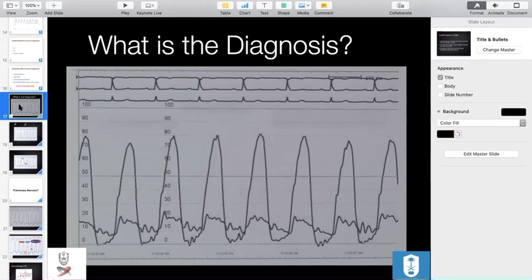Doctor, I have a question in the first slide, pulmonary artery and RV hemodynamics. Okay, the first case. Yes. Is it a spike and dome in the pulmonary artery or is this just an artifact? It's all artifact. You can't tell. Whenever you see this behavior, this is what we call whipping artifact. It happens when the catheter moves. And this is not a square root. There's a case where I'll show you what spike and dome morphology looks like.